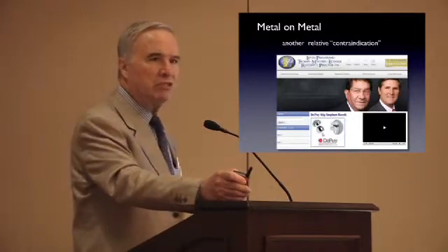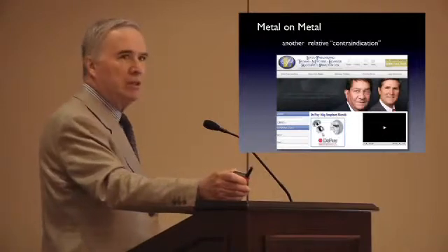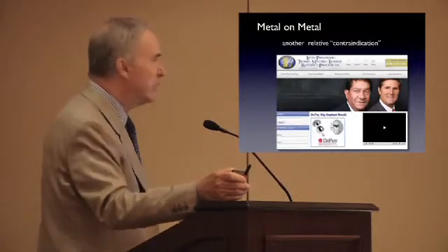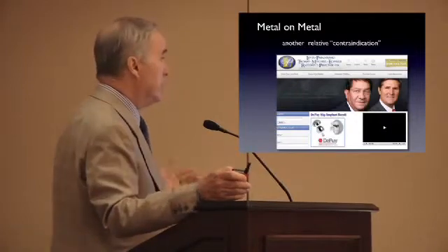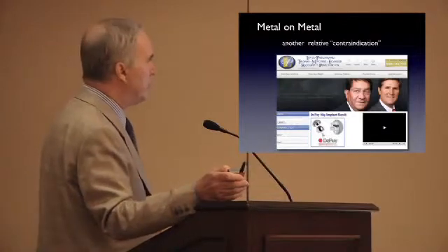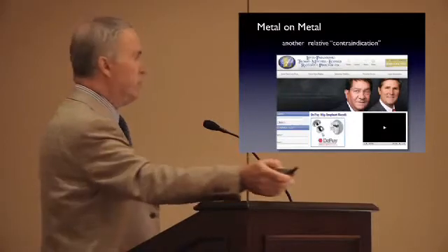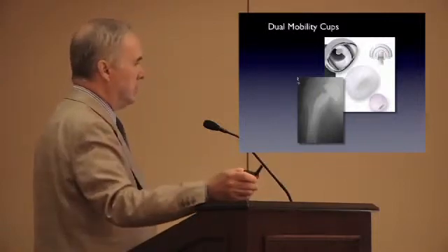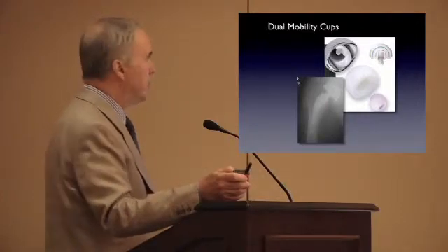With respect to our choice of bearing surfaces, we have another consideration now, and I don't know if you guys are going through this in your office, but every other patient asks me, do I have one of those recalled hips in? Well, unfortunately, in my case, I put in about 75 ASRs, and they're looking pretty good at this point in time. But it is a hassle, and it screws up your office day. So I still use some metal-on-metal implants by a different manufacturer. Dual mobility cups may represent an option in giving us stability in the small acetabular dimension patient.